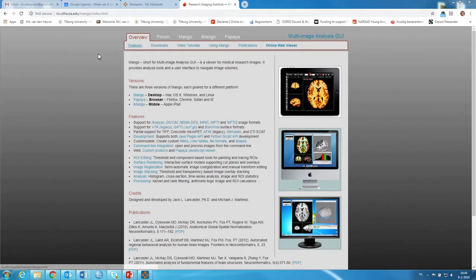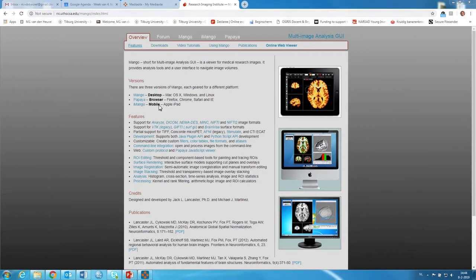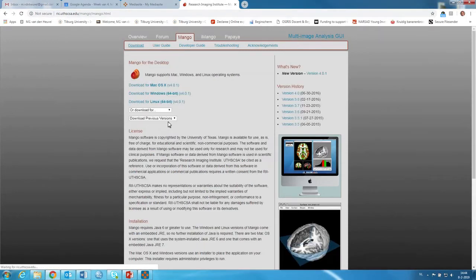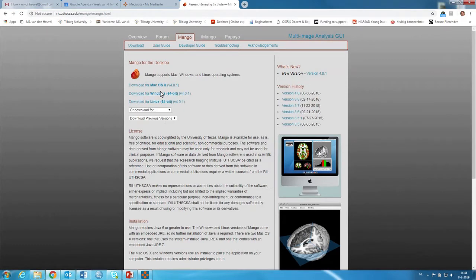Mango is really easy to download. You can go to the website and I'll put the website underneath this video. You can just click here and download it for Mac, Windows or Linux.